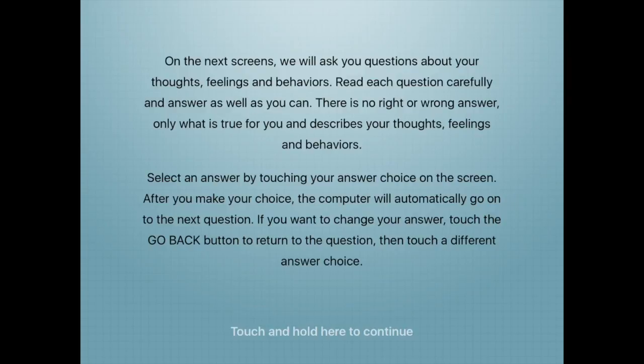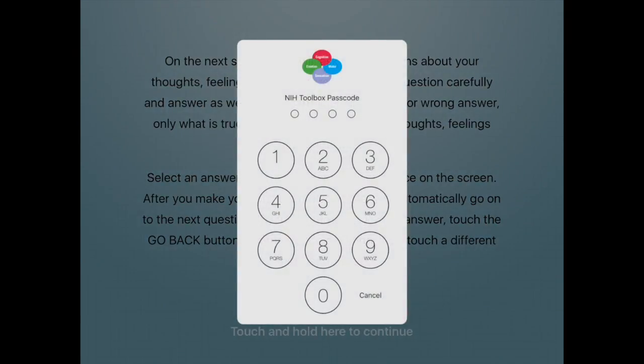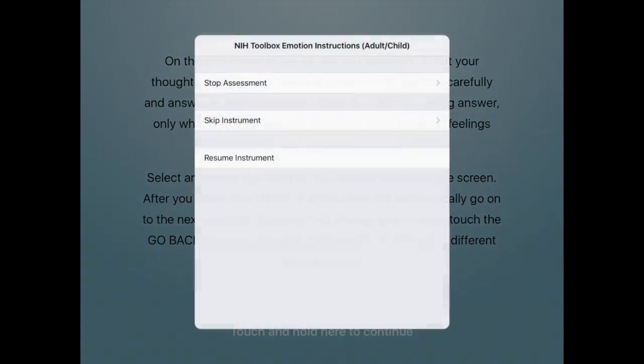An assessment can be paused at any time after launch. Put two fingers on the screen and rotate one of them clockwise as if making a half circle on the screen. Enter the administrator's passcode that was set up when the app was first launched. Select from the three options presented on the screen: Resume Instrument, Skip Instrument, or Stop Assessment.